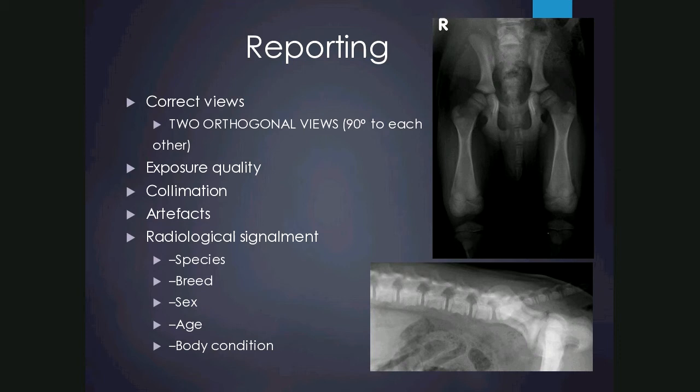For species, we can determine from the radiograph if we're looking at a horse, a cat, a bird, or a dog. Breed is not usually something we can determine in horses or cats, but in dogs we can determine whether it is chondrodystrophic — for example a dachshund — or brachycephalic like an English bulldog, by looking at the spine and the skull. For sex, the presence of the os penis or testicles tells us the patient is male.